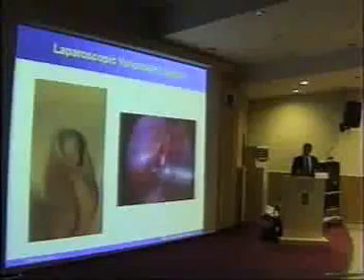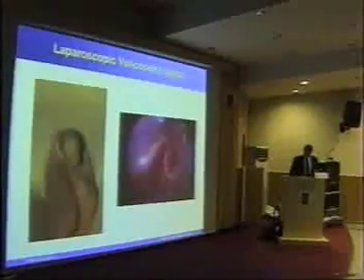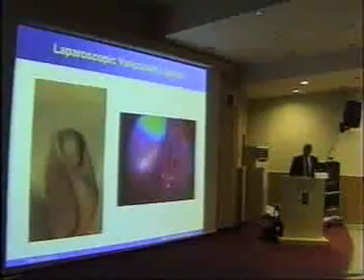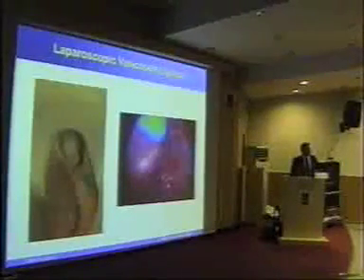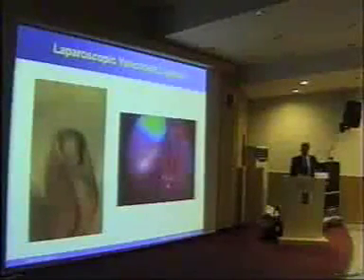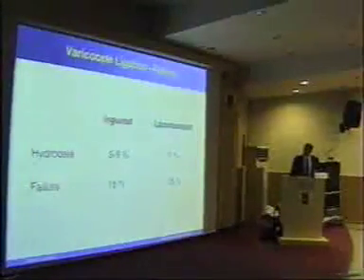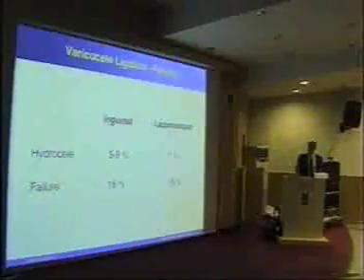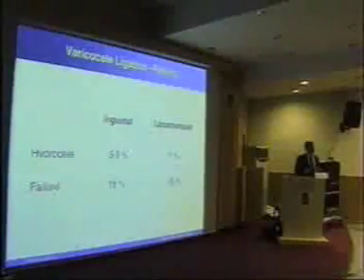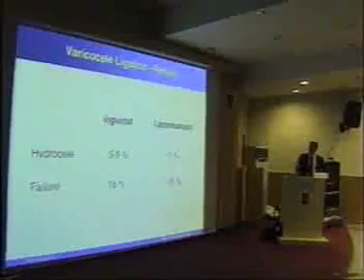You resolve the problem with the varicocele in over 80% of cases, and there's complications for this as for the open procedure. But you have 3 little port sites. The patient goes home the same day. The open approach, there is a muscle splitting incision above the groin. It's pretty tender and a very different experience for the patient. And if you compare the results, and don't forget our ideal is the results should be at least as good as the open technique. Let's not compromise on that.